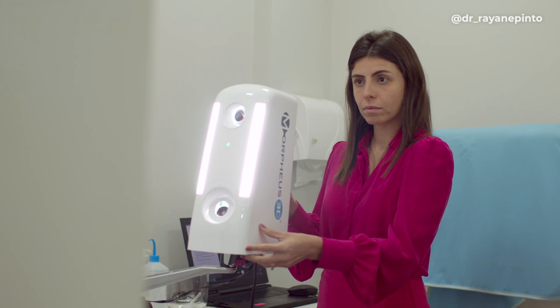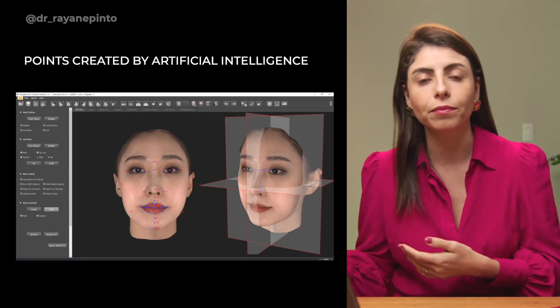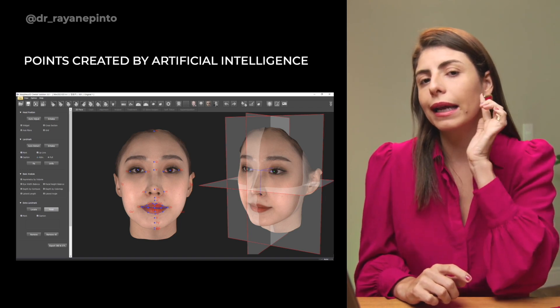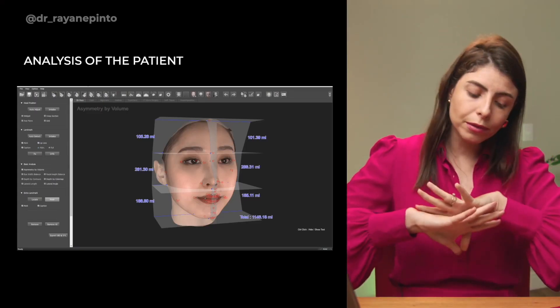You're going to align the patient's head if there is any issue, then position the planes correctly. After aligning, note that at this moment the points are placed by artificial intelligence, and you can make certain modifications if you want — if you see that the soft tissue gonion is not well positioned, you place it in the correct position. In general, the artificial intelligence works quite well. Once that's done, we move on to the analyses, because from there you can perform different analyses.